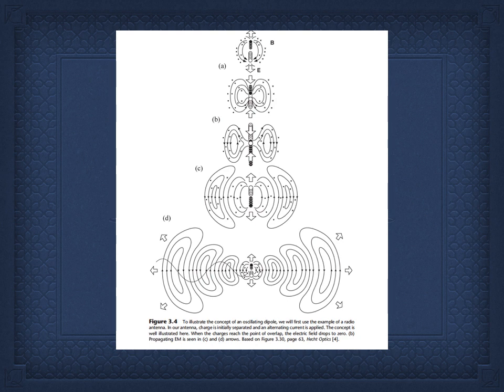When light hits a molecule like water or lipid, the molecule oscillates. If it's near the resonance frequency, like a guitar string has a resonance frequency, then it'll be absorbed. If not, the radiation oscillates the electron. And if we go back to Maxwell's equations, which some of you may not know, it's discussed in the textbook, but a changing electric field creates a magnetic field, and a changing magnetic field creates an electric field, and that was discussed also in the earlier physics lectures. So you re-radiate energy, but you don't necessarily re-radiate it in the same direction. And so you have to add up the phases and intensities of all the molecules that are being re-radiated.